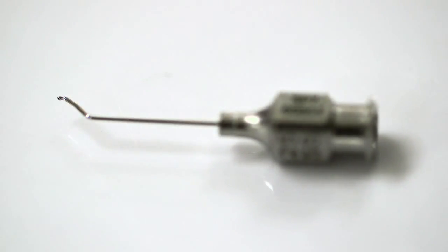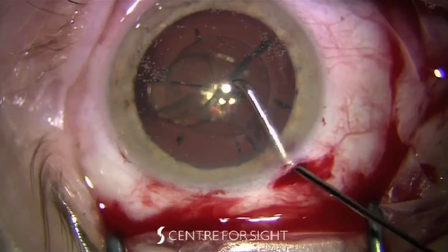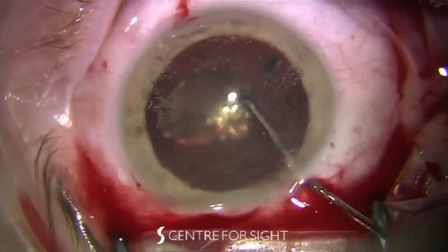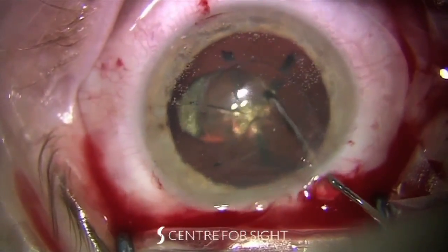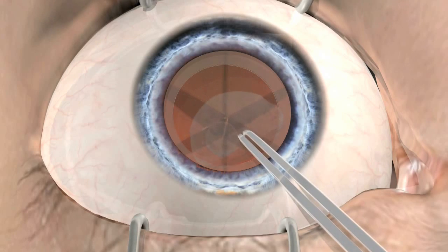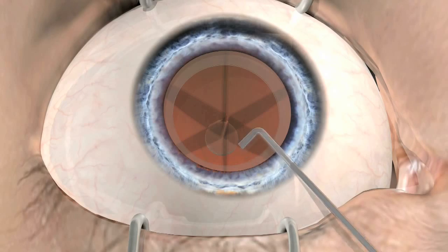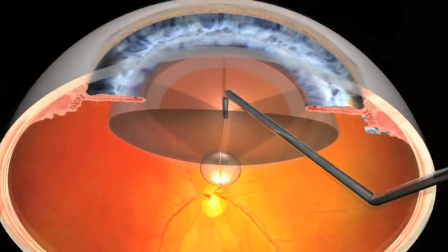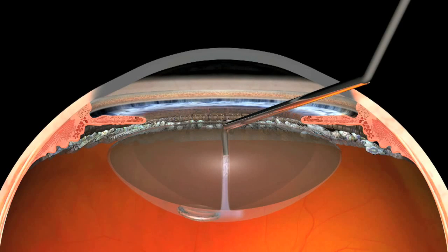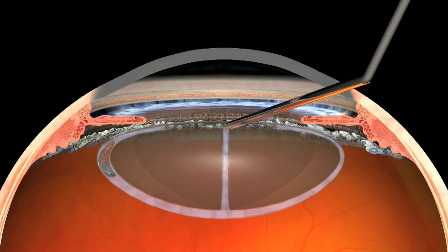This discovery led to the development of a cannula which served to both chop and hydrodissect the lens simultaneously. Watch the fluid wave and displacement of posterior gas as fluid is injected into the fragmented lens incision. This animation helps to understand the process of translenticular hydrodissection: fluid enters the lens through the cleavage plane, goes posteriorly and hydrodissects or hydrodelineates the lens depending on the depth of lens fragmentation. Excess fluid does not become trapped and comes out around the cannula, avoiding capsule block.